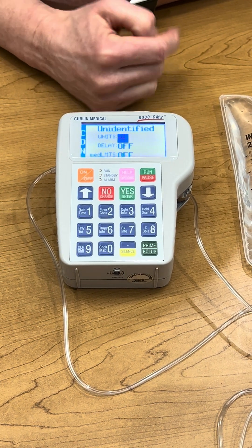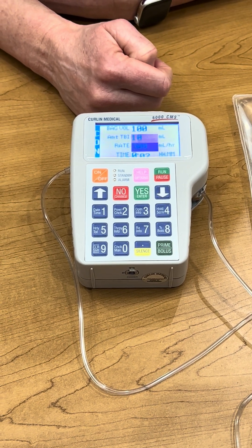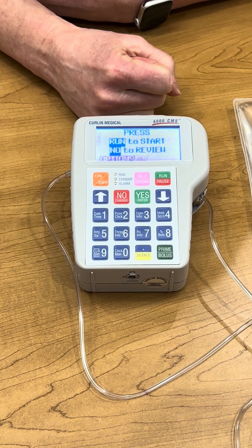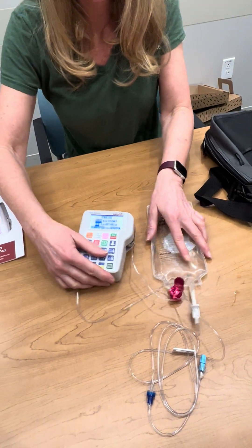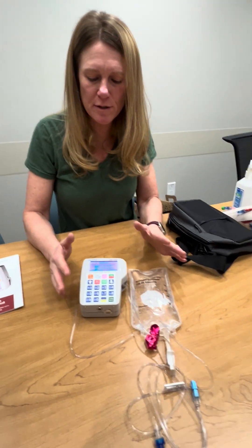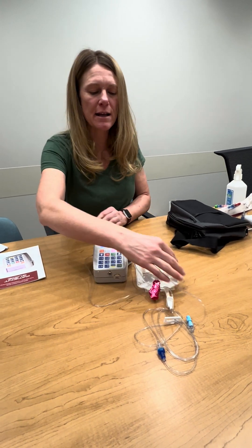This is going to scroll through the settings that are programmed by the pharmacy. Now we're ready for when the pump shuts off. If it's a longer period of time you can turn the pump off, just as long as you have everything loaded in here, and then you can turn it on before you hook up.